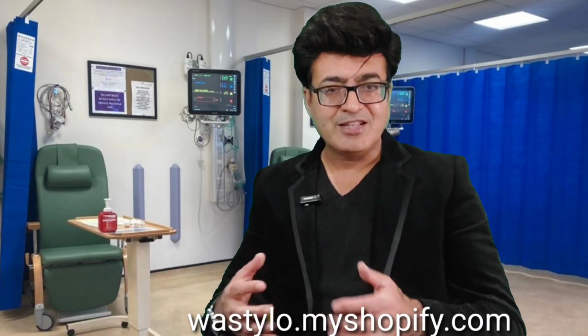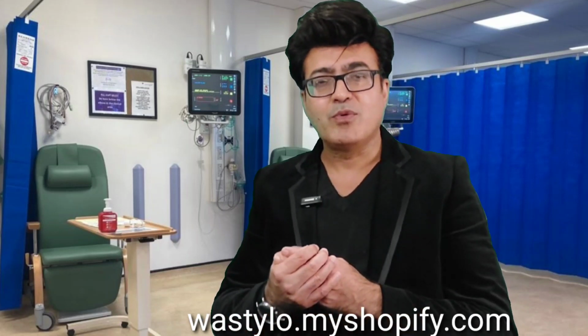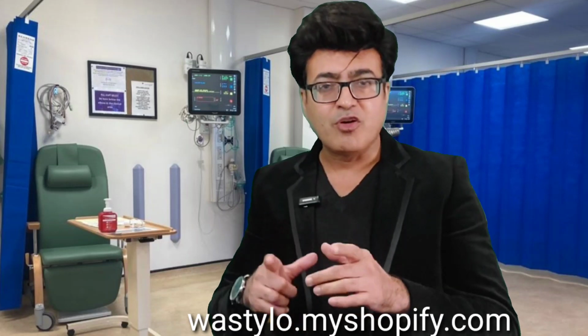As far as this lecture is concerned, today I'm going to talk about the x-rays of the lumbosacral spine. When you do a lumbosacral spine x-ray, it's for a particular reason. Sometimes you pick up a renal abnormality, sometimes some other muscle abnormality, and sometimes you may pick up vertebral abnormalities related to the lumbosacral spine.